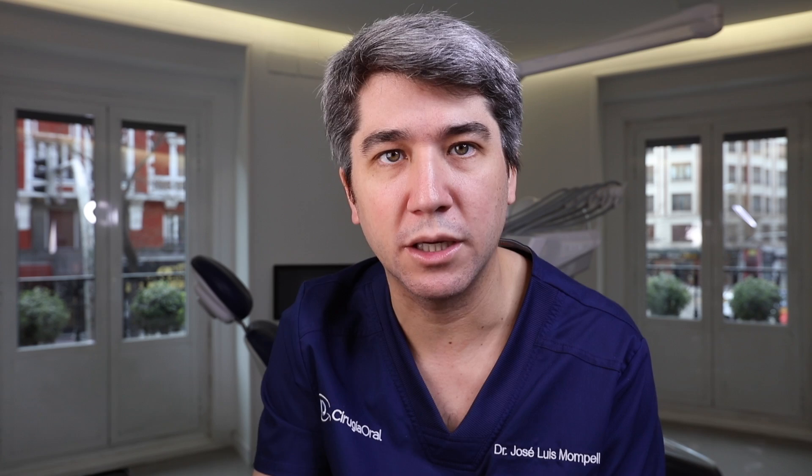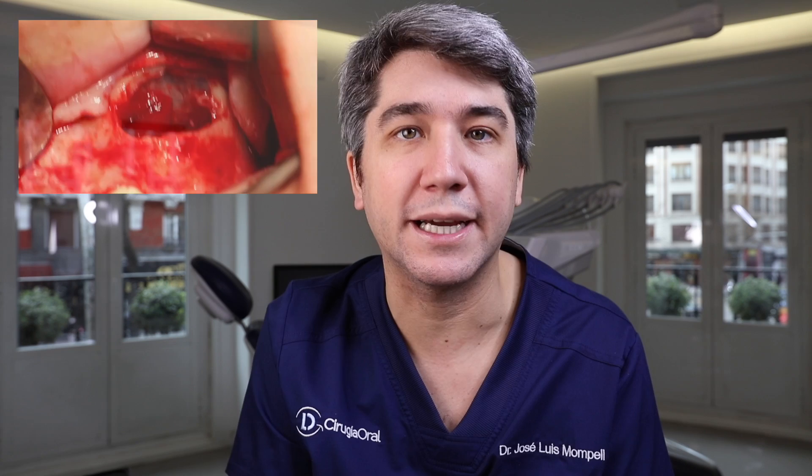We're receiving patients every single day in our offices asking for a fixed rehabilitation in the posterior area of the maxilla. Sometimes the posterior area of the maxilla can be a little bit tricky, because long-term dental loss will lead to no bone. We know we have the sinus in that area, and when our patient lost his teeth a long time ago, that sinus will pneumatize — it will increase its volume leading to bone resorption — and we will not be able to place implants in that area. So we need to augment bone in that zone in order to place implants in a safe and predictable way. The most common way to do it is a sinus lift augmentation.